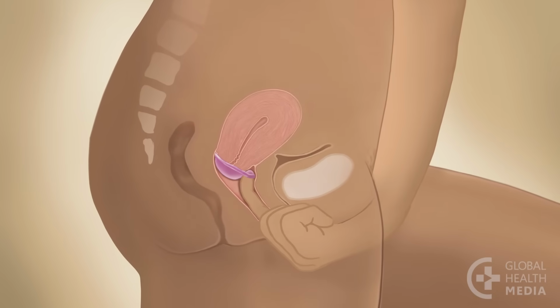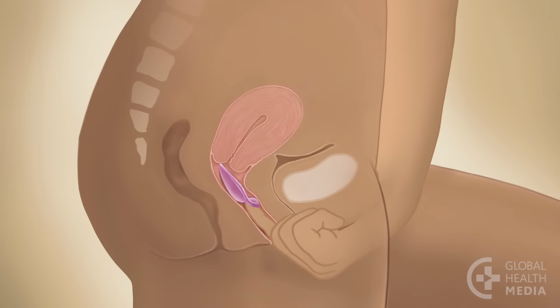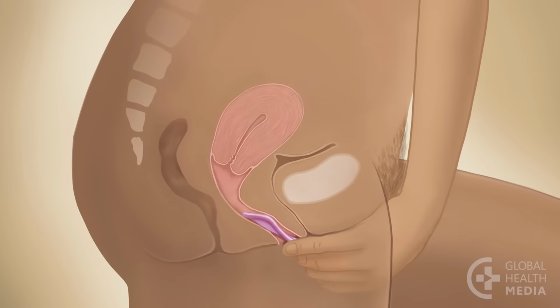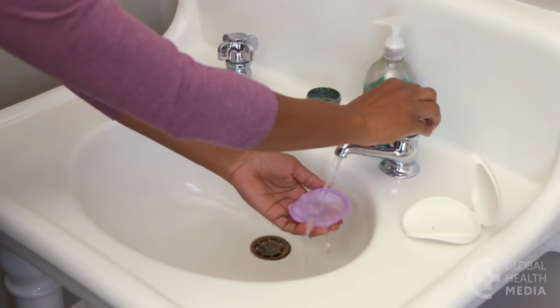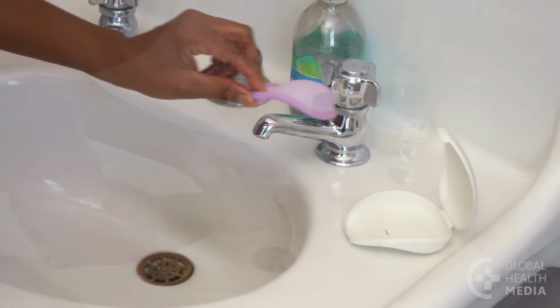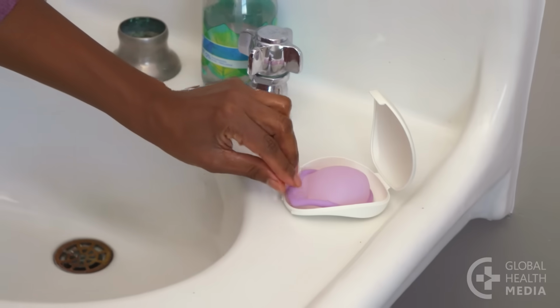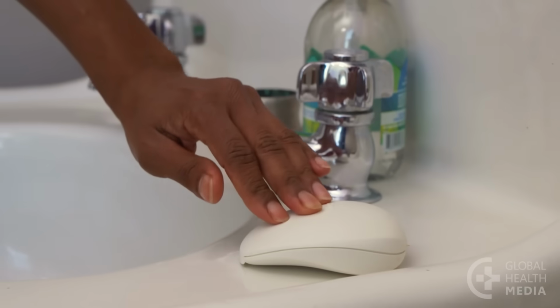To remove the diaphragm, hook your finger into the little indentation and pull it out. Then clean it with soap and water. Let it air dry in its open case and store it. It's reusable for 2 years.